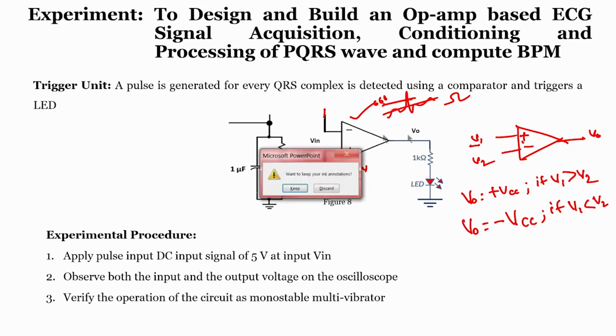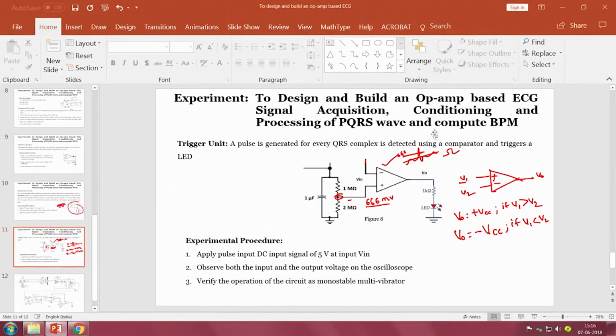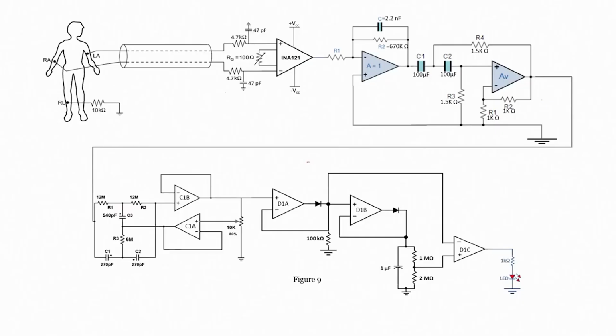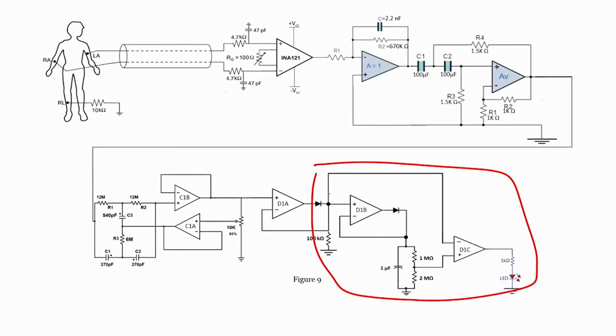So, what I will do is implement the same circuit. This particular portion we will implement now. Here we will apply the actual input signal. This input signal we are applying, and here it detects a peak and generates a threshold, which we will compare with the input signal, and we will observe whether we get pulses only when the input is greater than that or not.